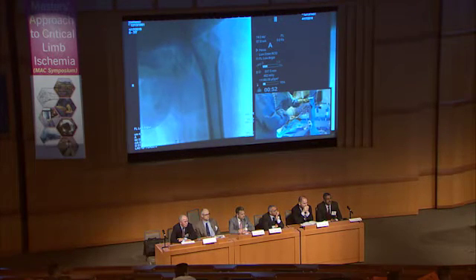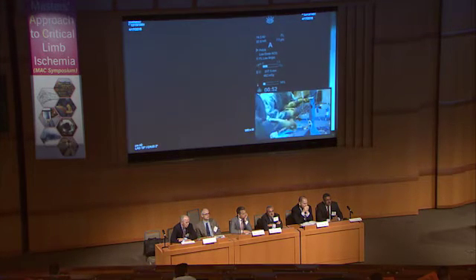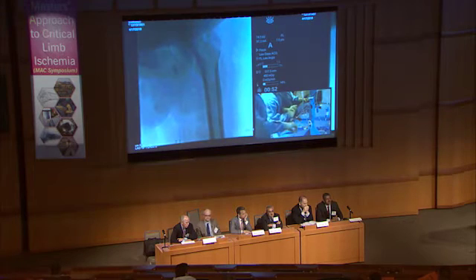There's a microphone right in the middle. Go ahead. Yeah, I think you could get some extra information here by using a small wire and an 035 base balloon, and with your balloon inflated in the SFA, take serial angiograms as you come back. That would give you an idea. It would be the reverse of what you're doing now, but it would show you if there's an SFA AV fistula. It would show you where it is.